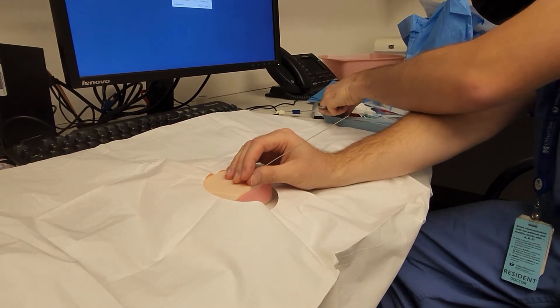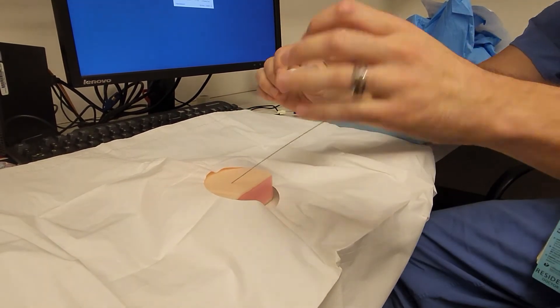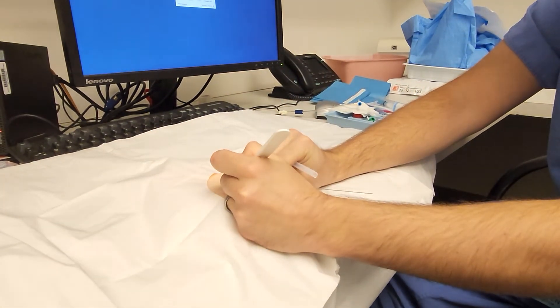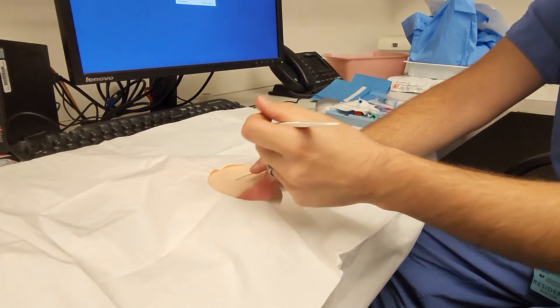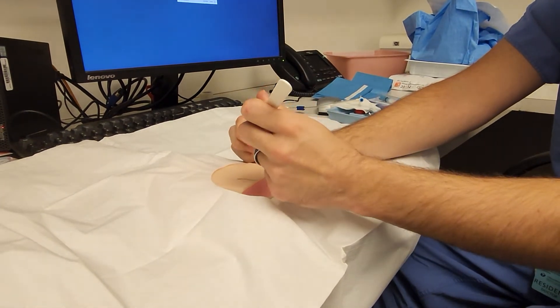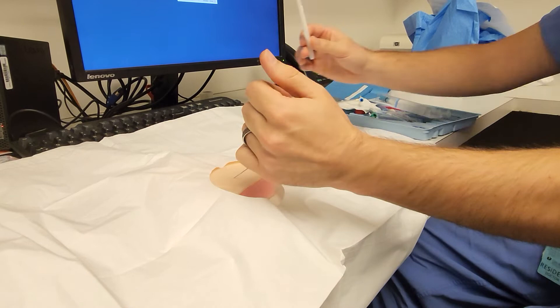Use your scalpel to make a small nick in the skin. This needs to be a little bigger than the one used when you make a nick for a triple lumen.